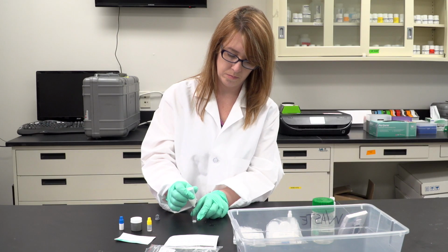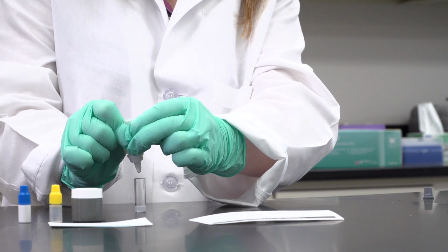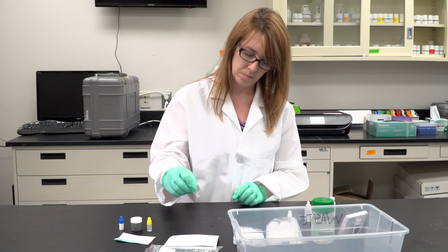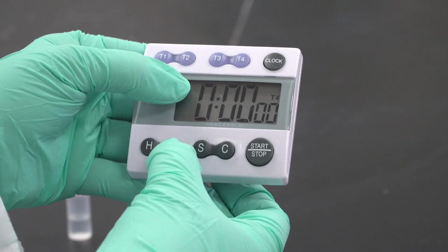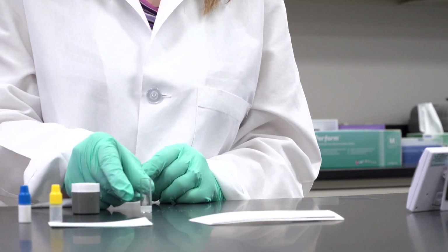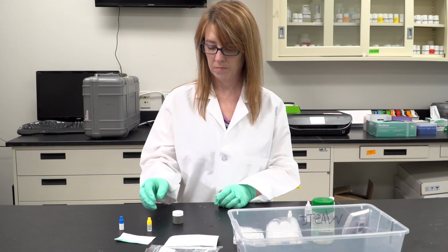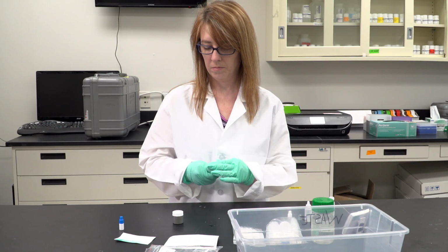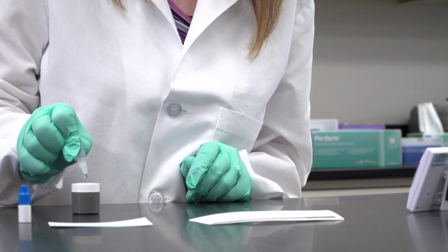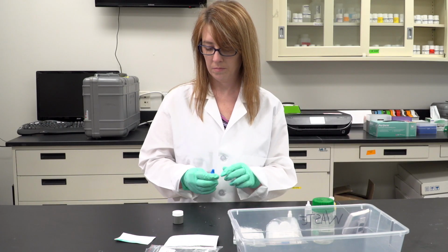Squeeze 10 to 20 drops of liquid into immunoreagent vial until the foam appears at the filter, without allowing the foam to get into the vial. Mix liquid in vial and allow to incubate for 2 minutes. Pour contents of immunoreagent vial onto test membrane device and wait until all liquid is absorbed through the membrane. Squeeze wash solution onto test membrane device and wait until all liquid is absorbed through the membrane. Squeeze chromogen liquid onto test membrane device.